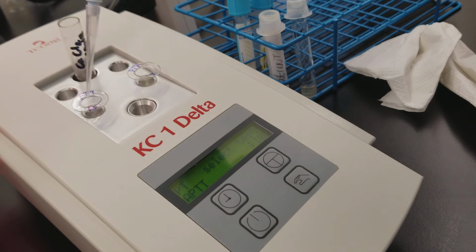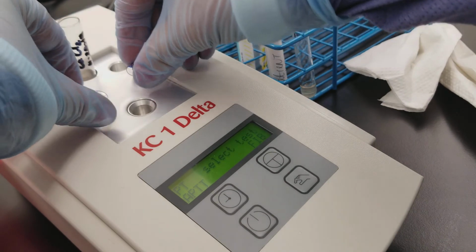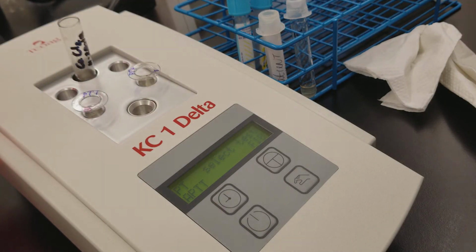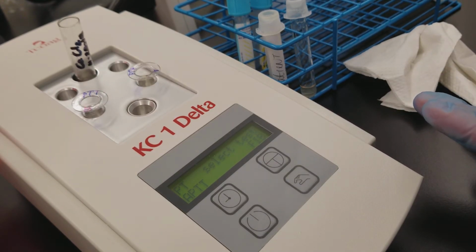All right, get rid of that. Okay, so let's mix them really quickly. Okay, having that in there is not going to do anything bad. So you don't need to worry too much about the time that they're in there.